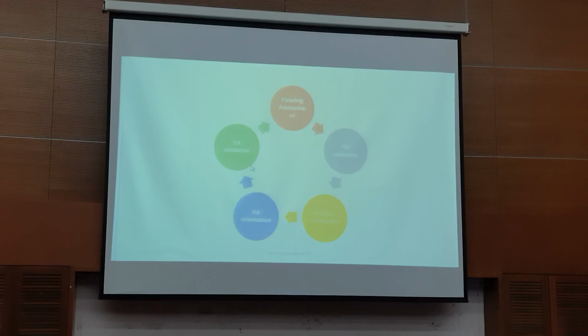Validation is when we do outcome measures, because in the end is how do you actually function in the outside world. It's not in our clinic. Kita ada clinical measurements, tapi validation is more into how they actually function in the real world, luar daripada klinik. So bila saya letak a circle, because we always have at any point actually, if we need to do, when we do validation dan dia ada problem dekat situ, then we probably need to reassess and so forth. So I want you to understand that that's a process.